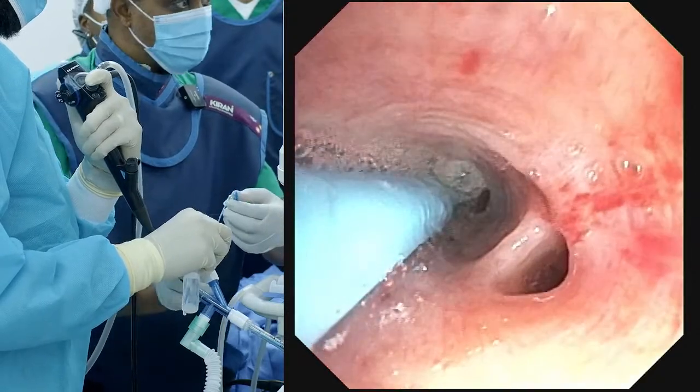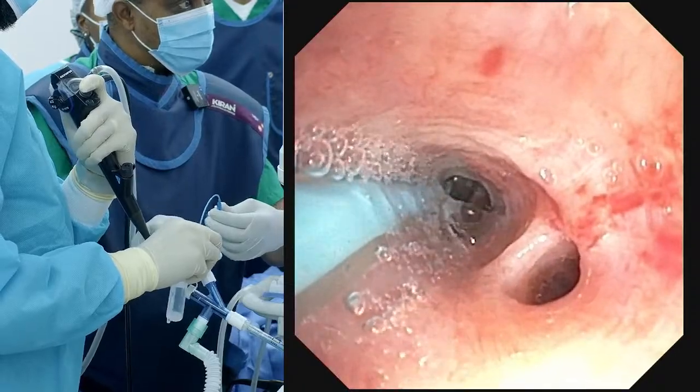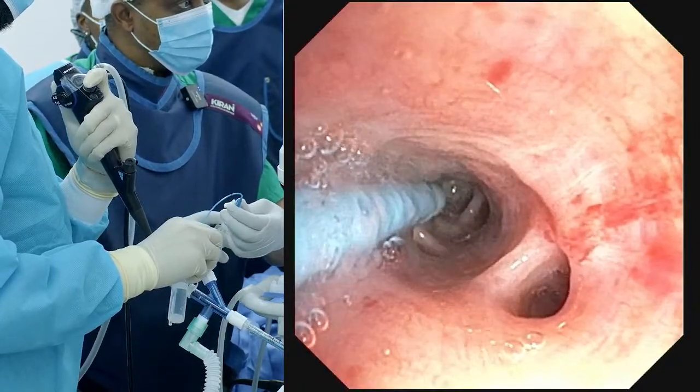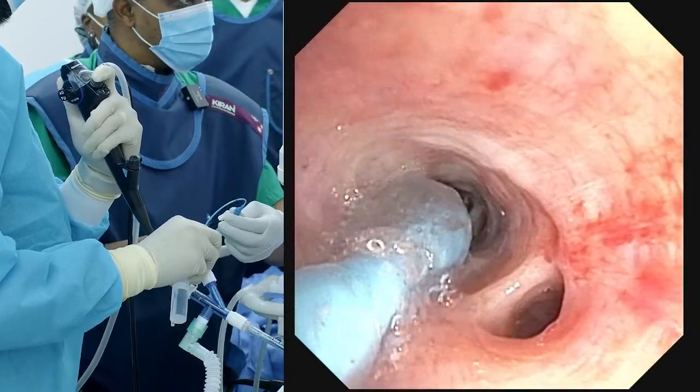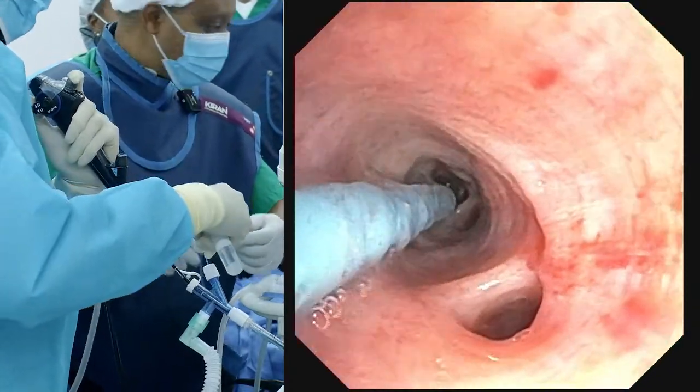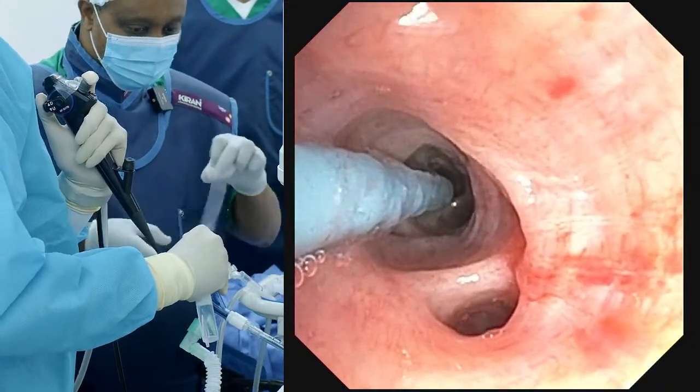But just deflate it, pull it out a bit. So you see, you can do it this way. That's the balloon. So we can start here. We'll tape this here now because we like it staying in place, and it does move. You saw it last time.